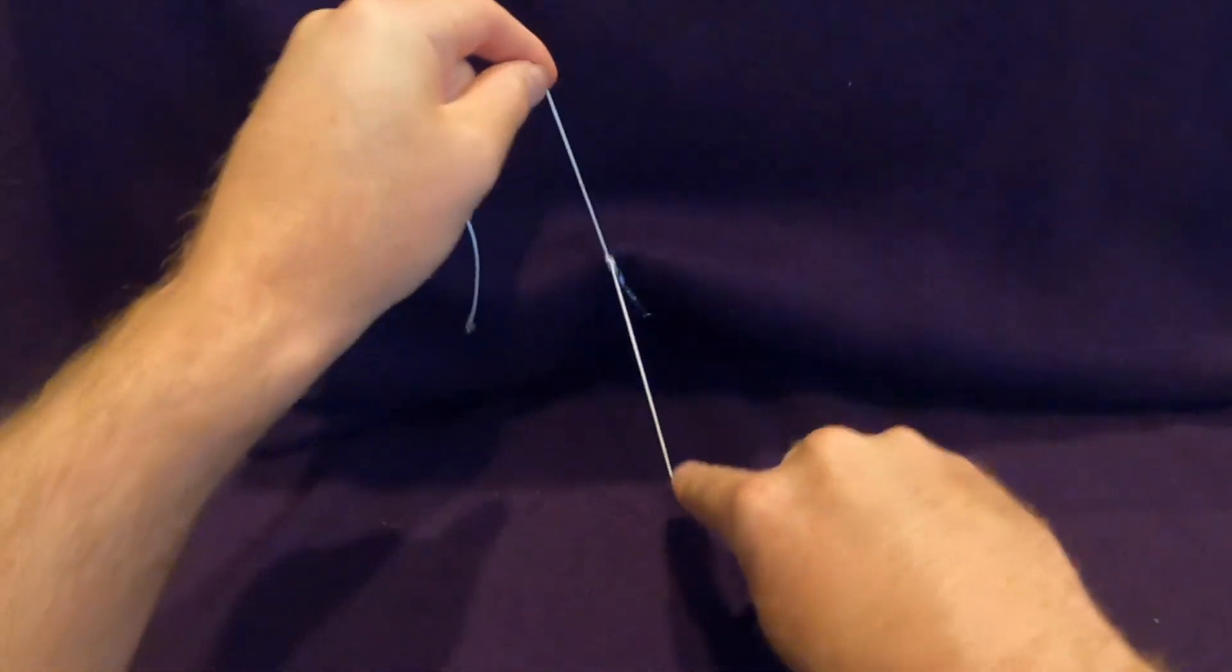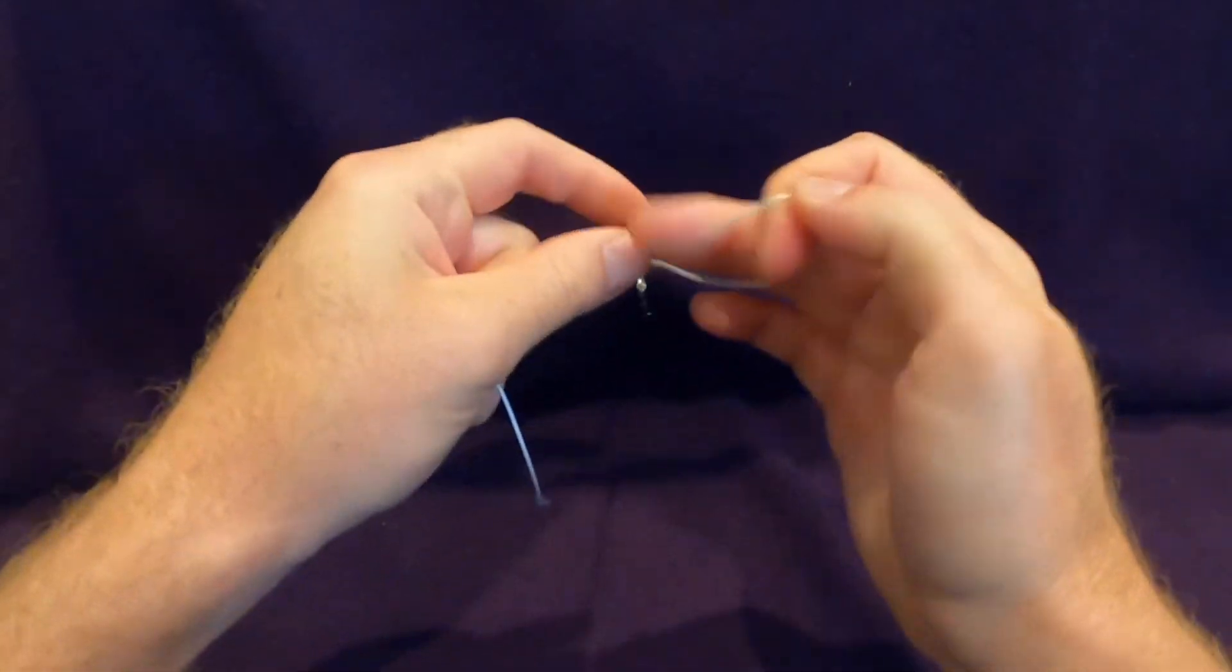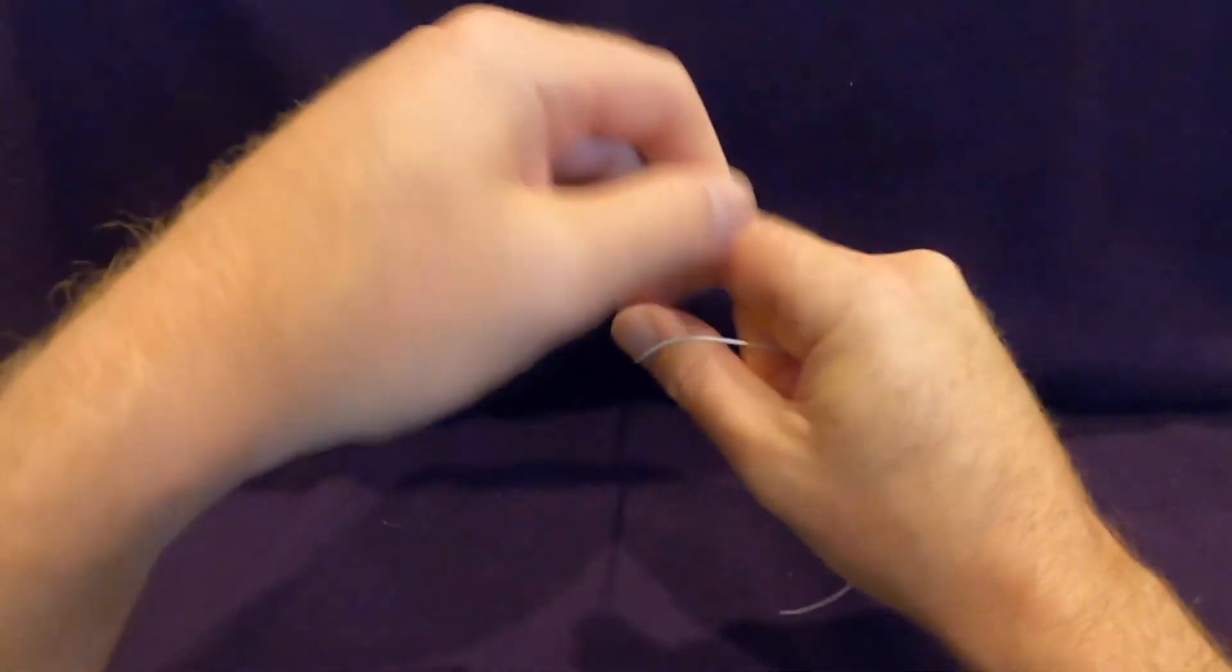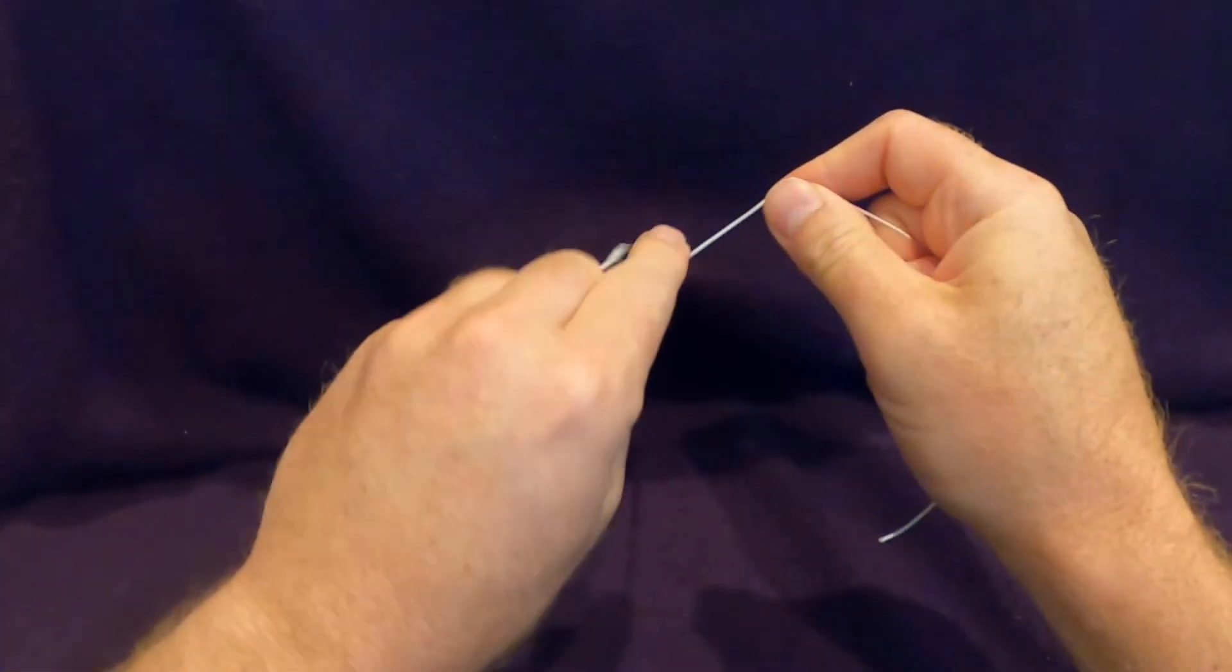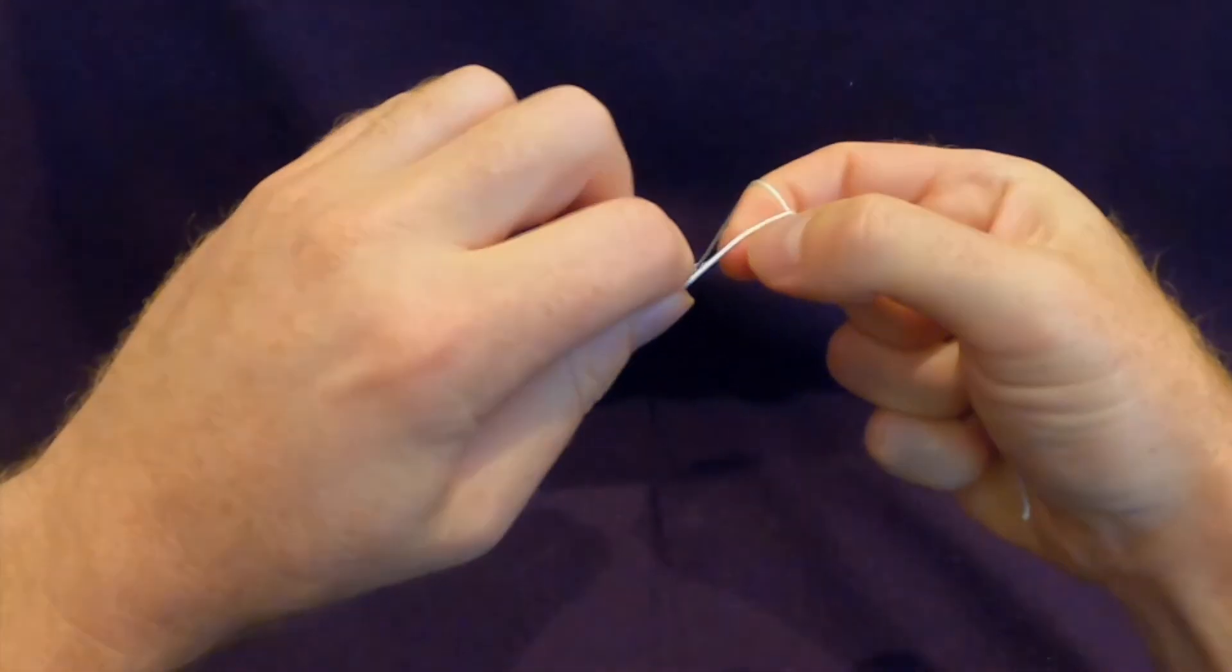When learning how to tie two-hand surgical knots, it's best to tie without gloves. Tying with gloves makes it harder to feel the suture which can make it more difficult to tie knots. Large practice material such as string or shoelaces is ideal to help develop muscle memory before trying this in the operating room.